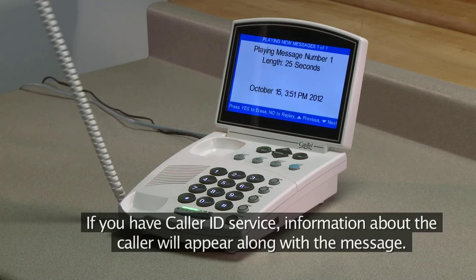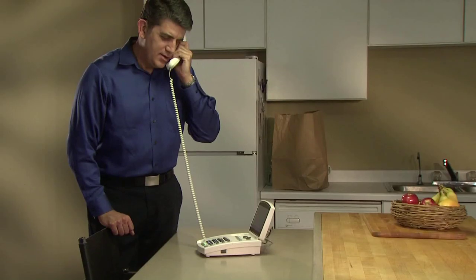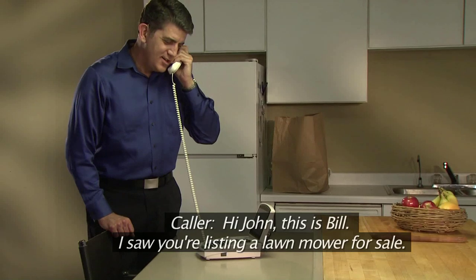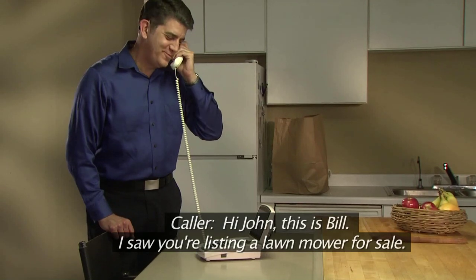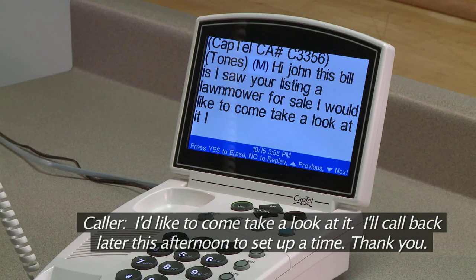If you have caller ID service, information about the caller will appear along with the message. For example: "Hi John, this is Bill. I saw you're listing a lawn mower for sale. I'd like to come take a look at it. I'll call back later this afternoon to set up a time. Thank you."